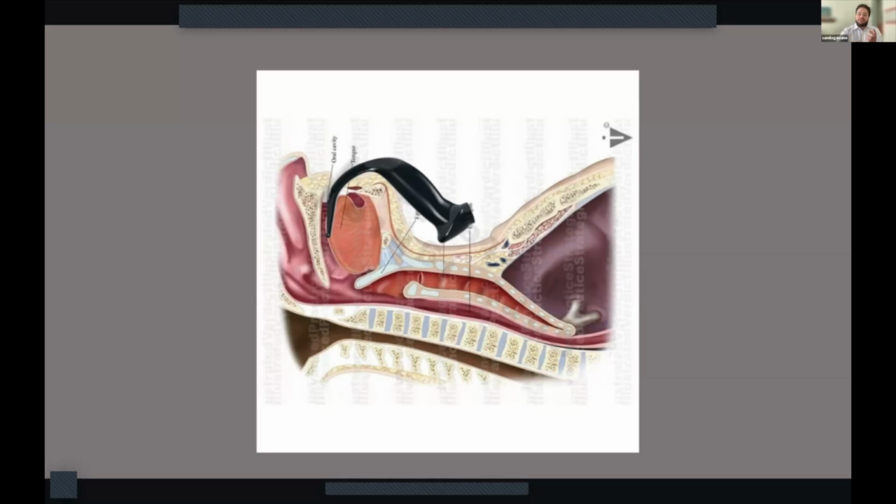So the trick really is to do less of the insertion and a little bit more of a rotation, towards you or counterclockwise in this case, which will sit that laryngoscope in the perfect location. Again, the blade in the vallecula, activating the hyoepiglottic ligament, lifting the epiglottis, and exposing your view. So a lot of times when you have trouble inserting the laryngoscope, even though the mouth is wide open, it's because you're trying to force the laryngoscope straight in instead of following that natural curvature, which is built to go around your oral pharynx.